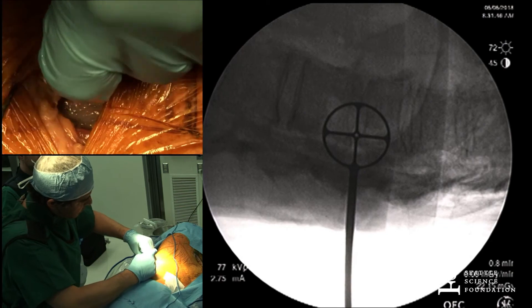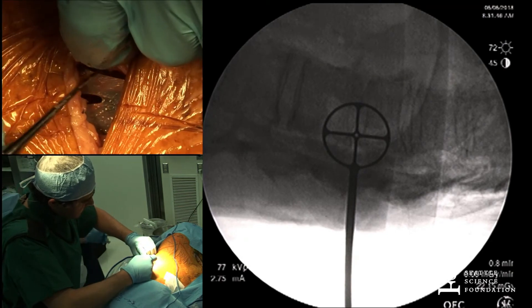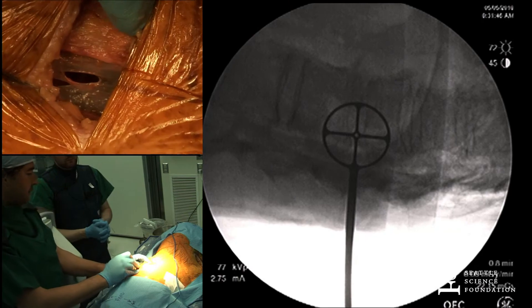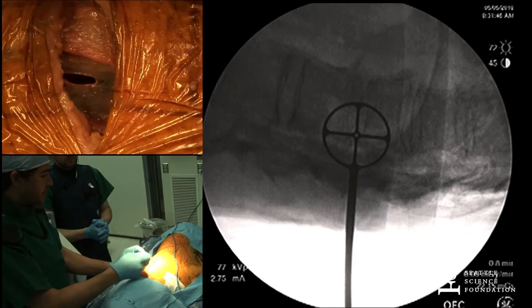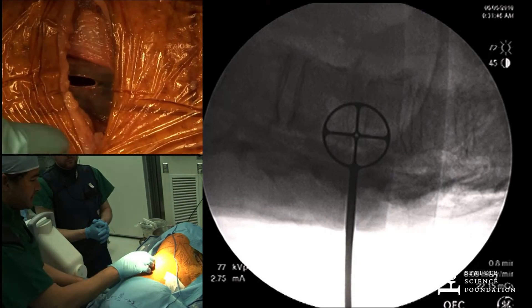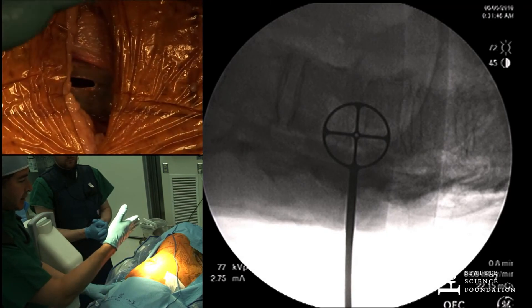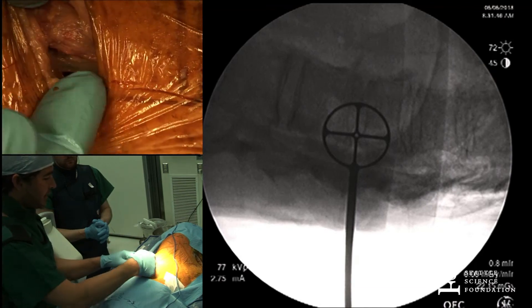That's essentially it. Both Dr. Taylor and Dr. Smith are going to talk about how to manage a pleural tear and a visceral tear — what are the potential complications? But essentially, depending on what company you use, all the retractors are available and each company has a great set of instruments. You can literally just go right down on the spine after you've taken the rib head off and done your extra-pleural dissection.